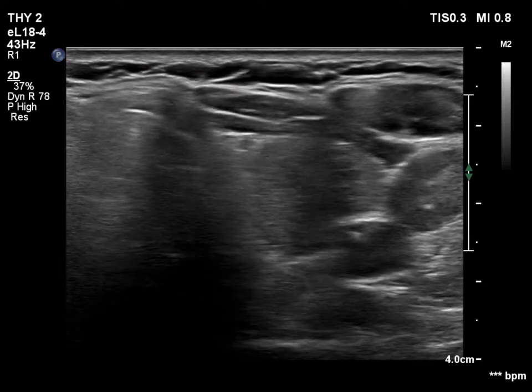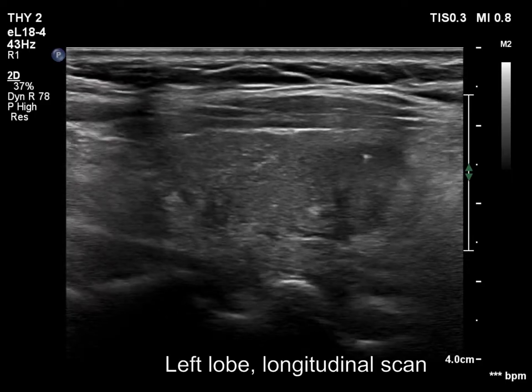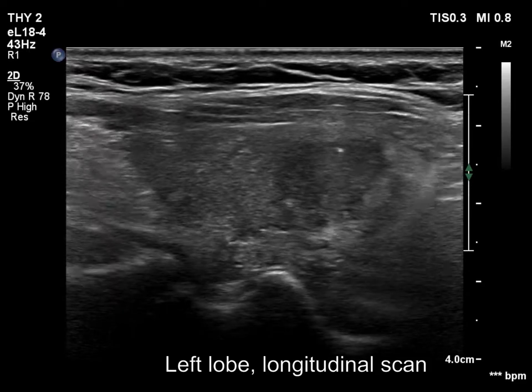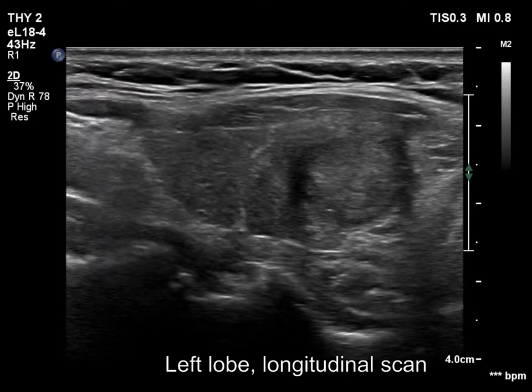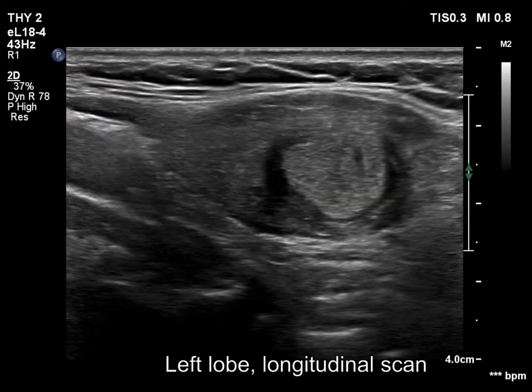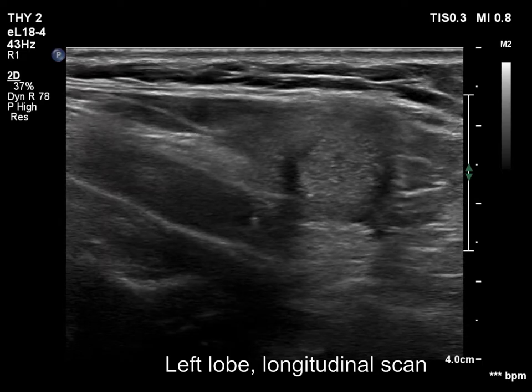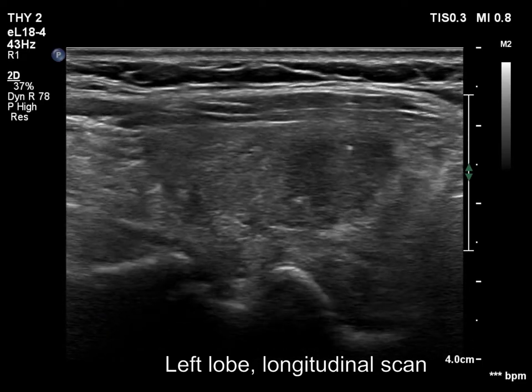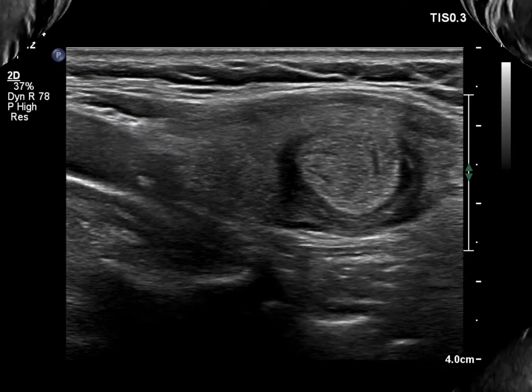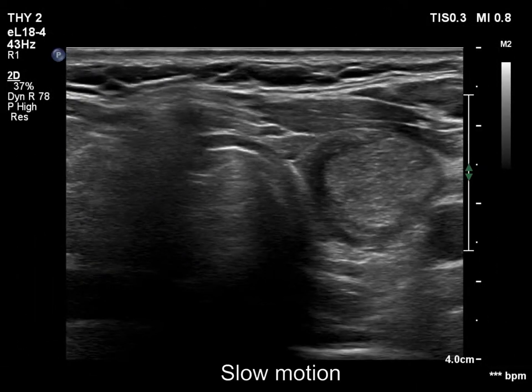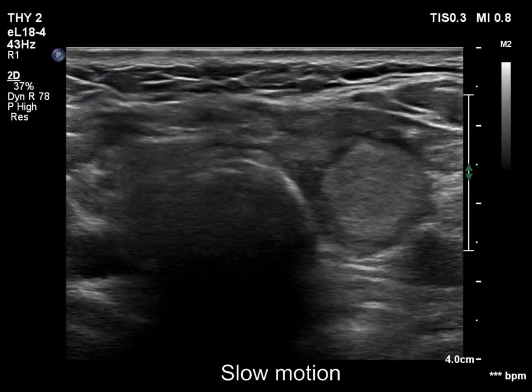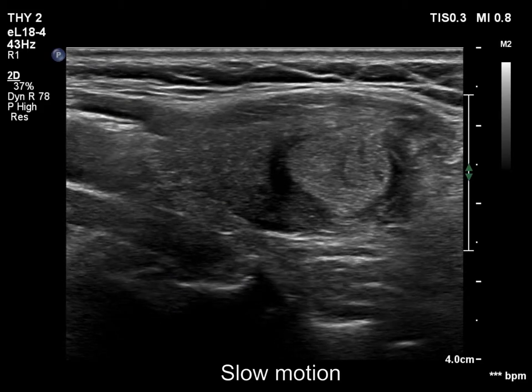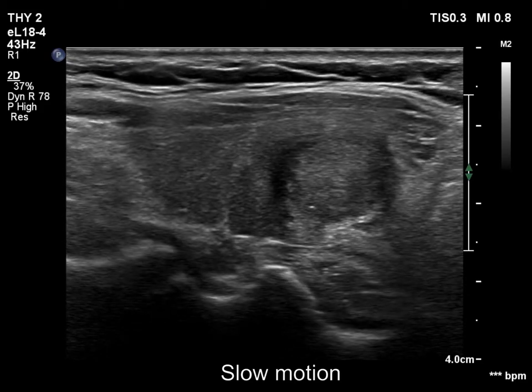At first sight, it can correspond to microcalcification. However, this granule is related to a ventral cystic area. In my opinion, the possibility of microcalcification cannot be fully excluded, but there is no way we can be sure of that. A single, isolated punctate echogenic granule with doubtful interpretation should not be regarded as microcalcification when classifying the nodule.